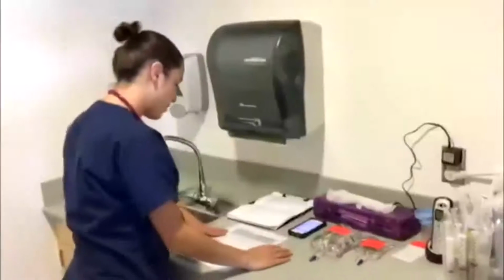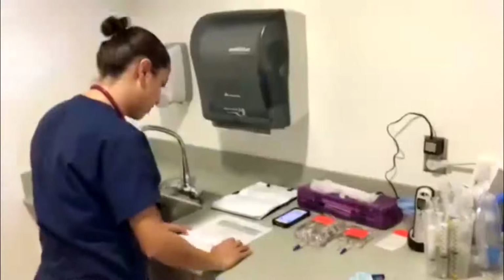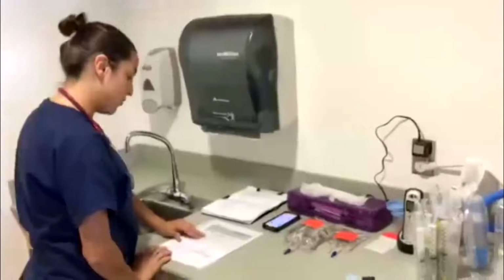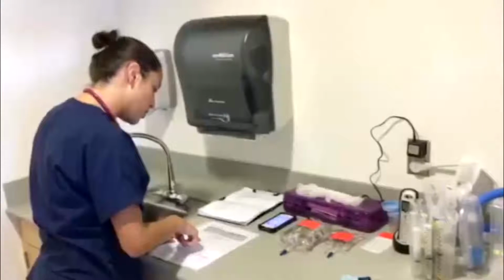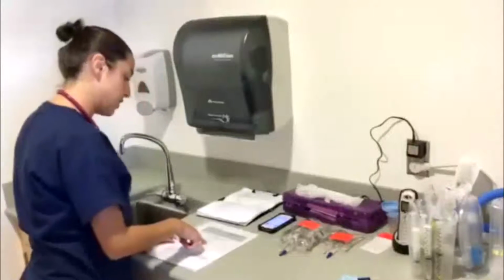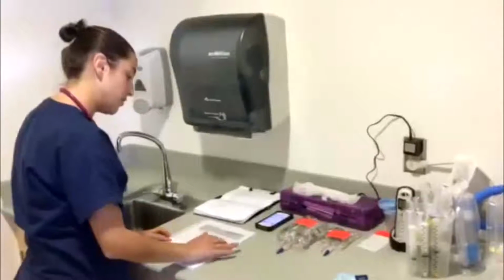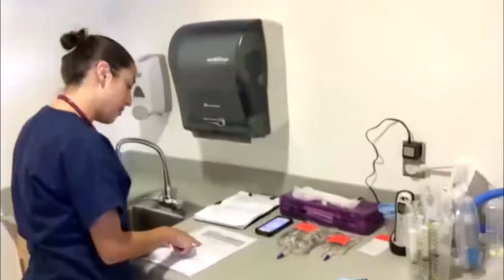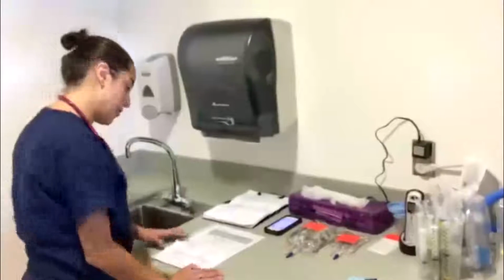Okay, so right now I'm going to review my physician's orders against the MAR. That will be my first check. Today I have a couple of orders from the physician, 2 IV fluids. The first is Zosyn, 3.375 grams in 100 milliliters of 0.9% sodium chloride to infuse over 4 hours every 8 hours. And the second is the primary fluid, which is 0.9% sodium chloride at 75 milliliters per hour.